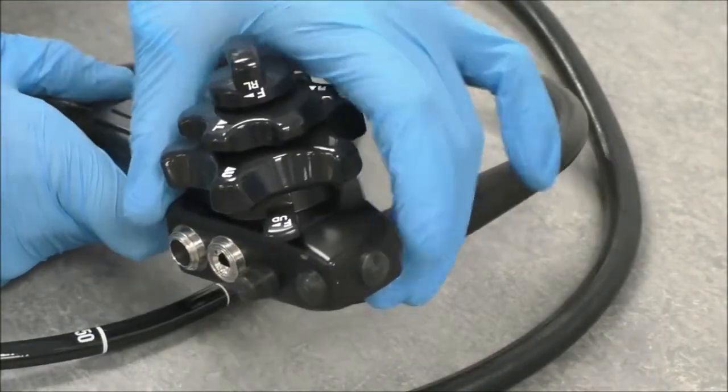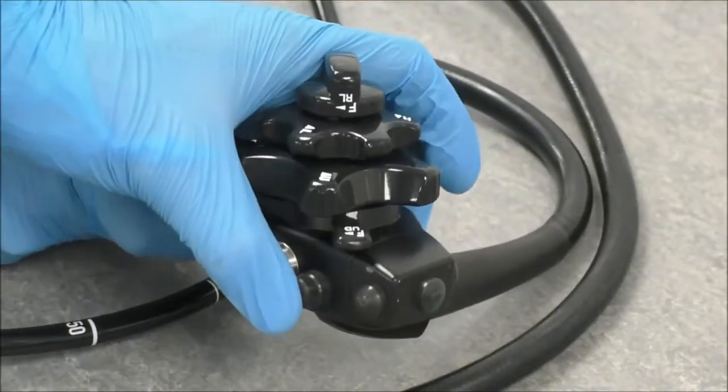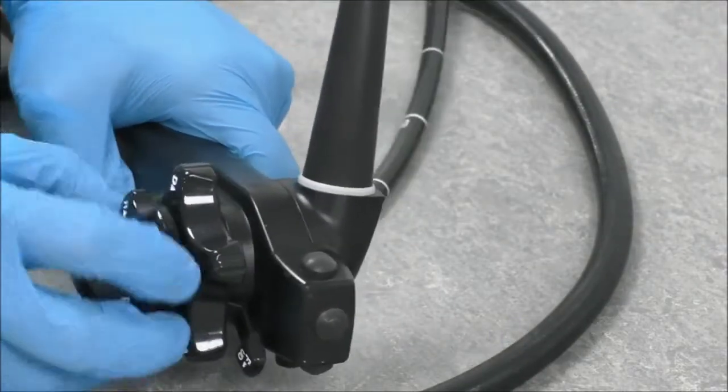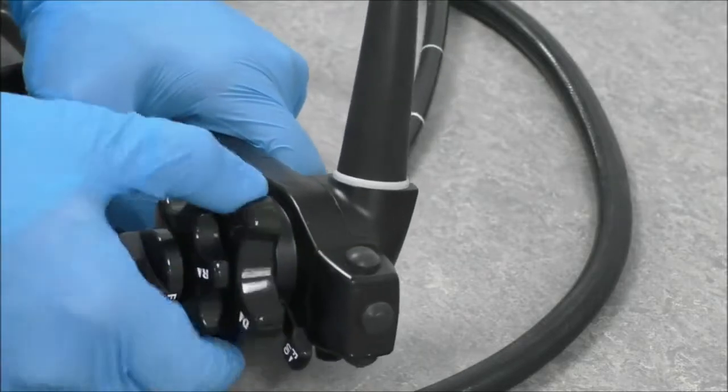Manipulate all the video buttons. If any are torn, air bubbles will come out through the tear. And rotate the locks and angulation controls. Again, if any O-rings are damaged, this will cause a leak.